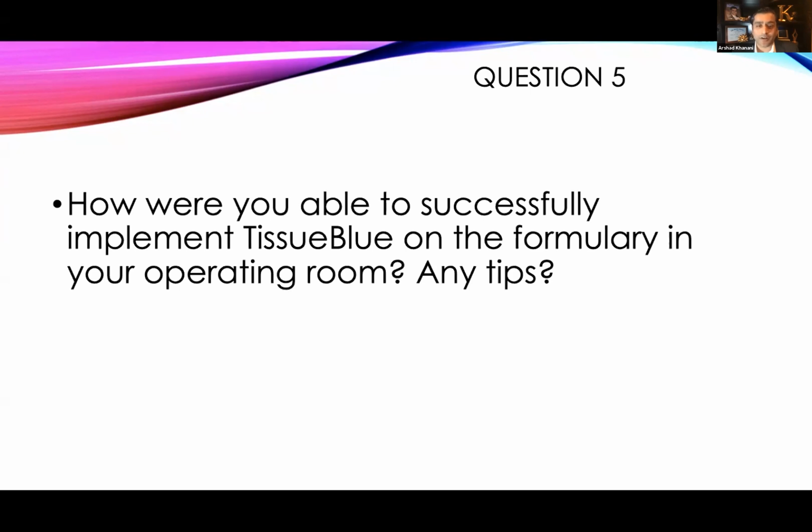I'm scarred for life because I was doing 2 cases. I don't know if it was you, Carl, but I was doing cases at a hospital, and I couldn't blame Carl for this one. What happened was I turned the infusion on in a diabetic phakic patient, and the lens turned white. And I'm like, what the hell? Carl is not operating, it's me. I can't blame him, and he's not even here. So I thought, maybe the infusion touched or my trocar touched. I do a second case and the same thing happens. And I'm like, what the hell?